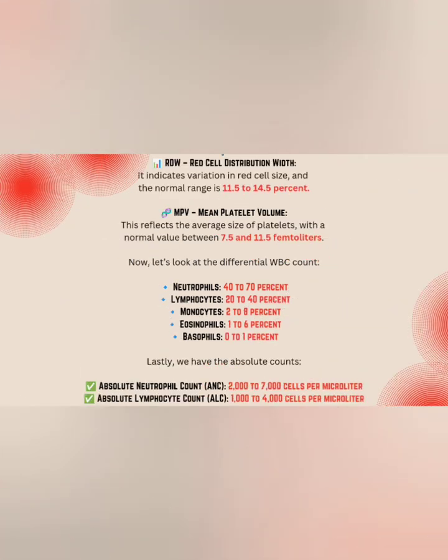RDW, red cell distribution width, it indicates variation in red cell size, and the normal range is 11.5 to 14.5%. MPV, mean platelet volume, this reflects the average size of platelets with a normal value between 7.5 and 11.5 femtoliters.